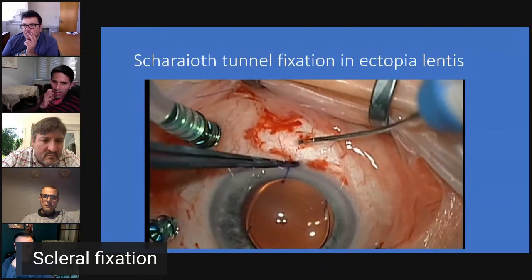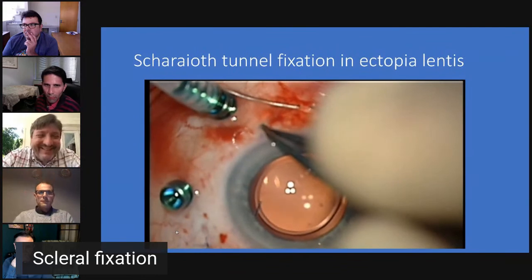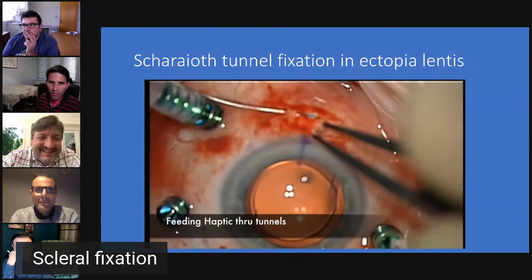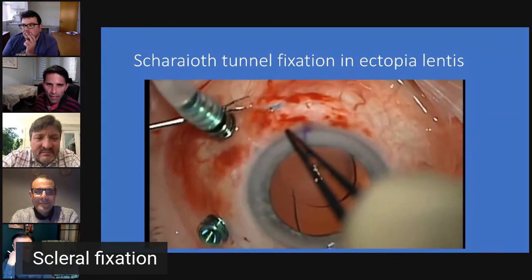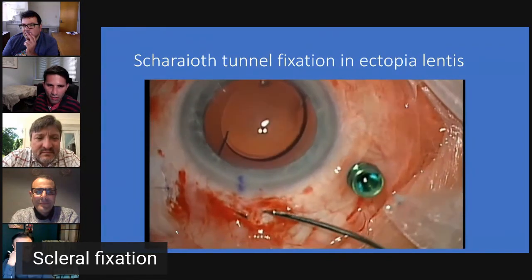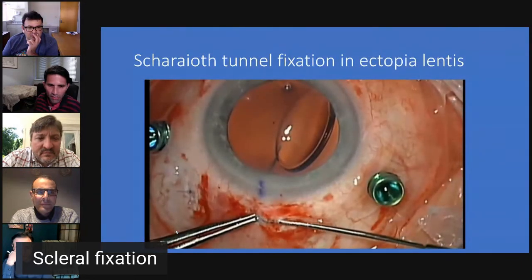Again, it can be a bit of a fiddle to get that through the tunnel that you made very nice and tight so that it doesn't move around, but it's so tight that it can be a challenge to get through. When starting this technique, don't be fooled to think that it is a piece of cake. It's like everything, it's a challenge to learn.